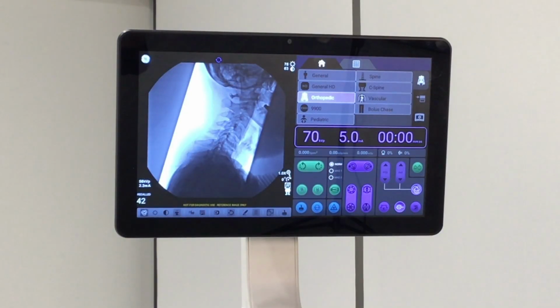And don't forget to collimate. There are iris and linear collimators with preview lines so that the collimation can be applied accurately without unnecessary exposures, and it limits the exposed area.